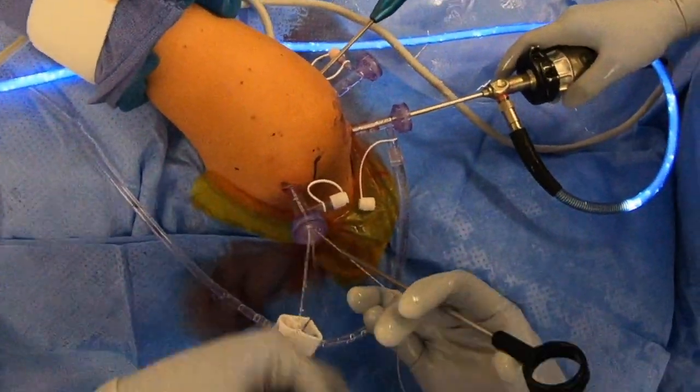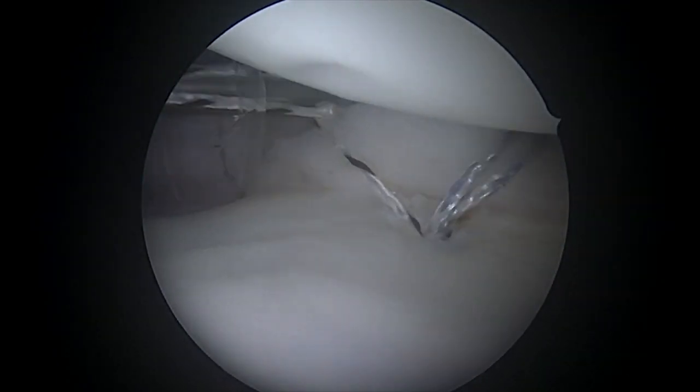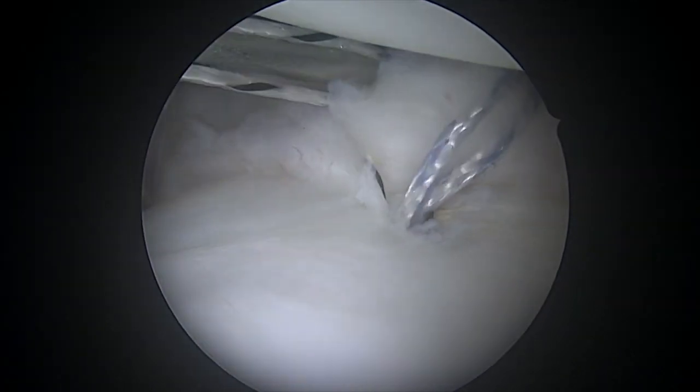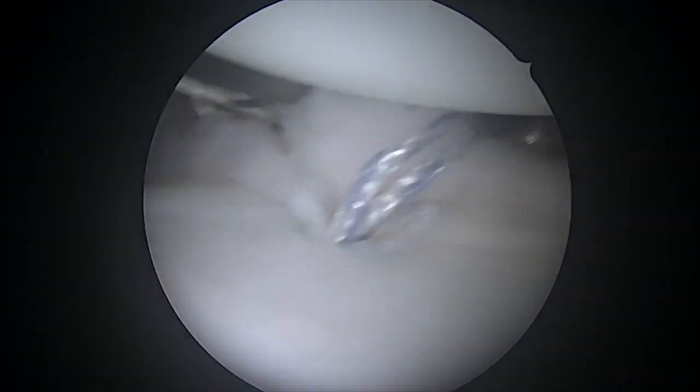We're going to repeat this process for what are called double-loaded anchors. There are two sutures in each anchor, and we repeat until we feel we've completely tightened the ligaments around the bottom front portion of the socket of the shoulder. You can see that those things are coming together nicely so far.